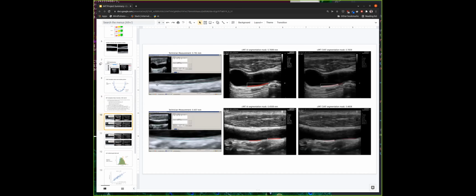Okay. In general, the neural network, the new model of the IMT region, I think is working really well. Hopefully, this is coming through okay. So what we're seeing here is the SonoCalc screenshot, and then the IMT segmentation mask, and then the CVAT mask. And so if you zoom in, let's see if I can zoom in here.